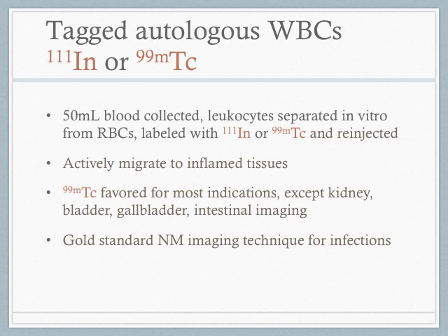And then your tagged white cell scans or leukocyte scans. Remember, they're going to be tagged with indium or technetium. And it's a two-step process. First, you take the blood from the patient, separate the leukocytes from the red cells, and then you label just the leukocytes and re-inject back into the patient. And those leukocytes will actively migrate to inflamed tissues.